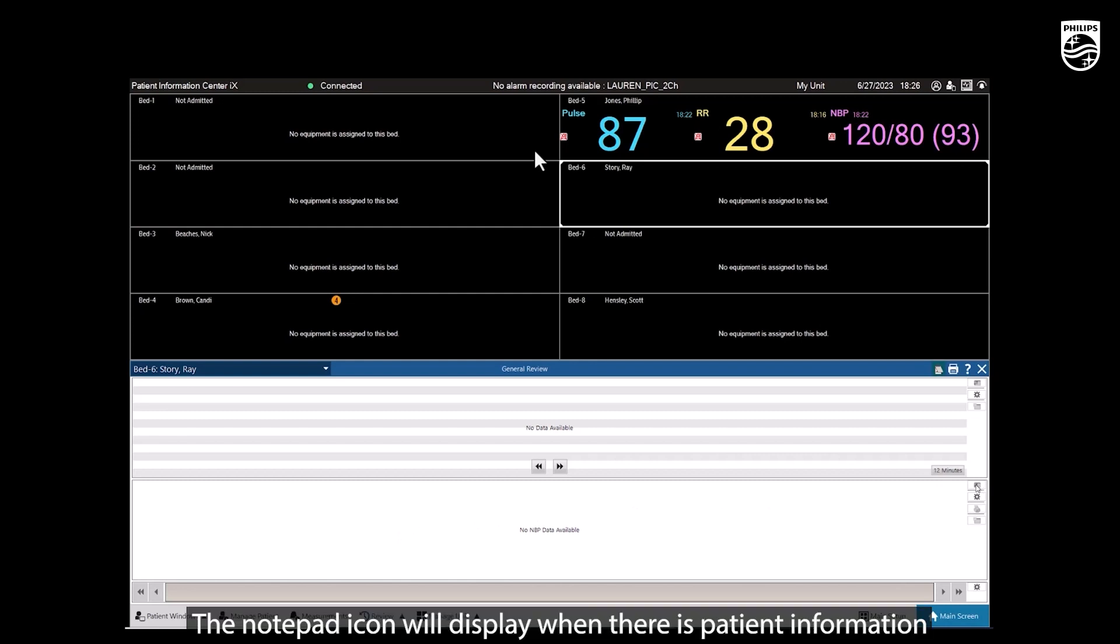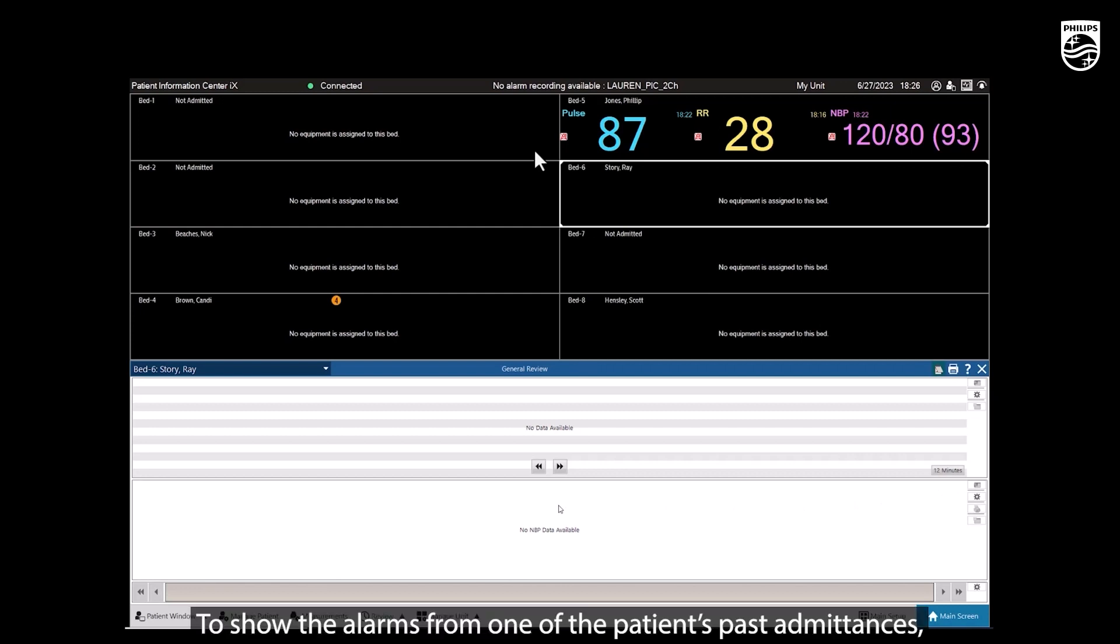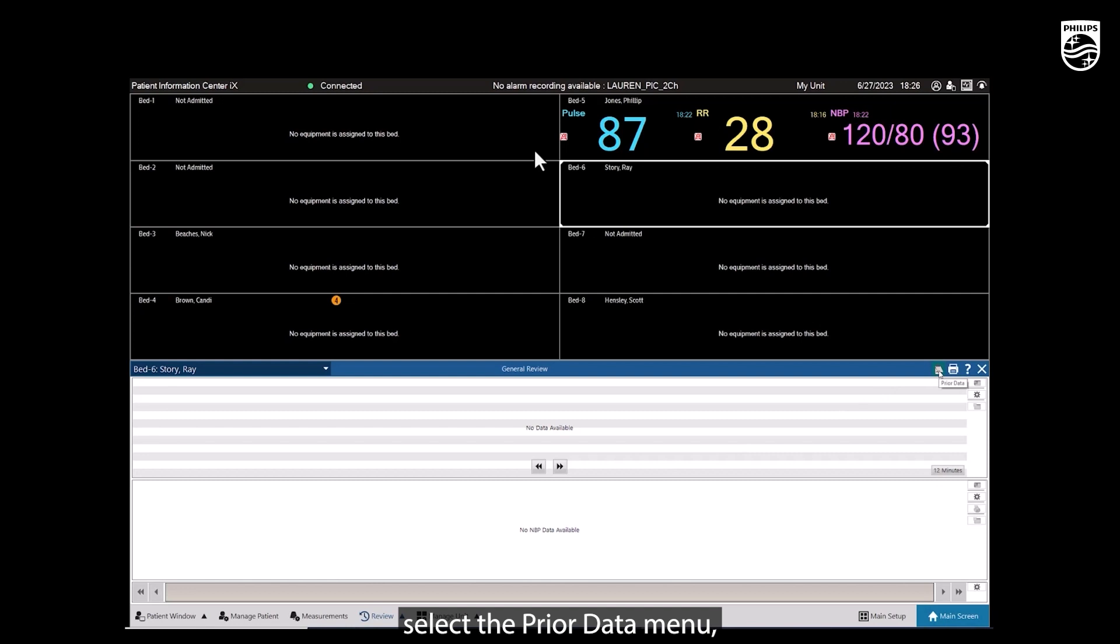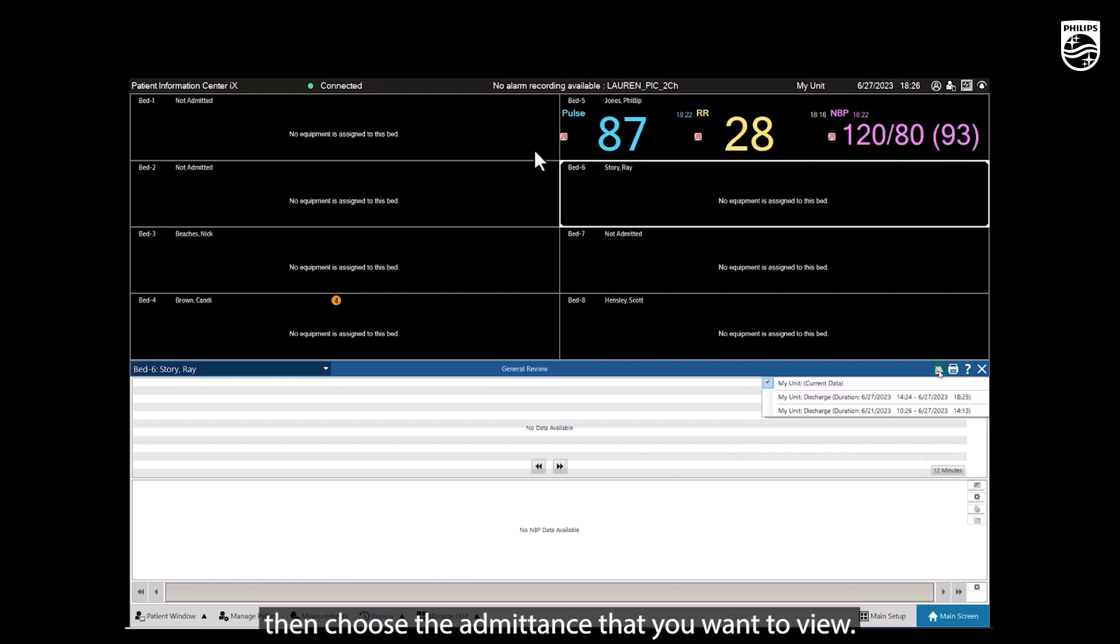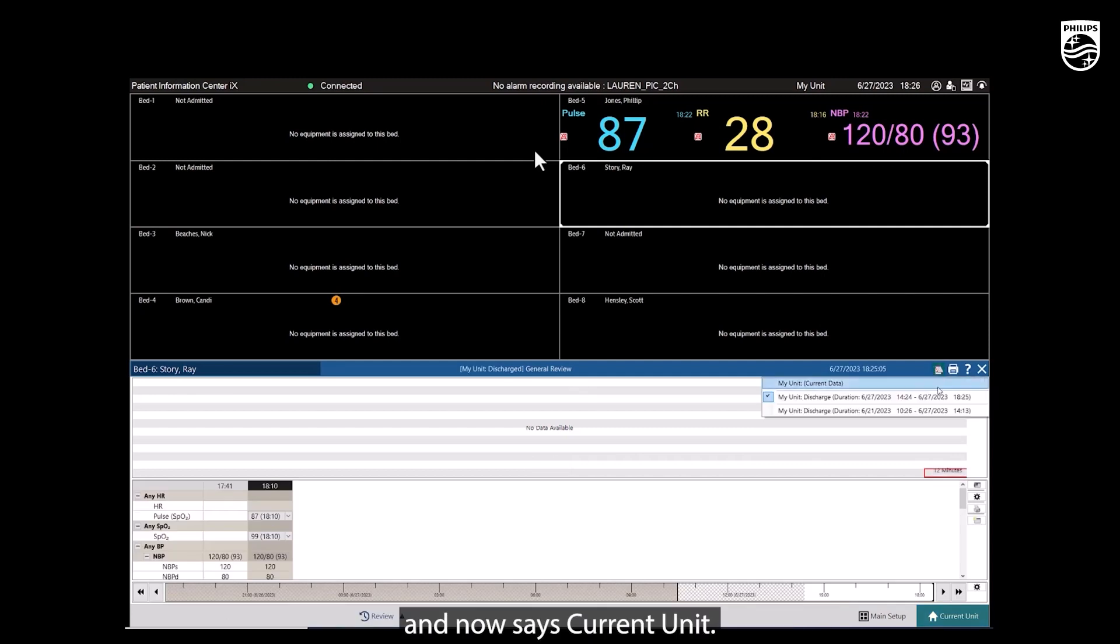The Notepad icon will display when there is patient information from a prior admission. To show the alarms from one of the patient's past admittances, select the Prior Data menu, then choose the admittance that you want to view. The icon in the bottom right changes to teal and now says Current Unit.